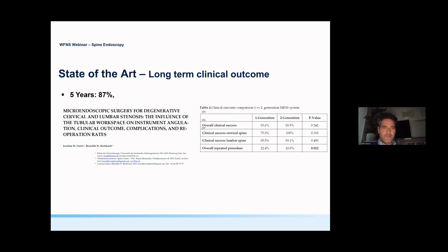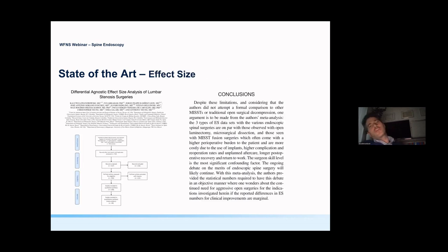Then if you go back to the literature and do a meta-analysis of a couple of thousand patients that have been operated either with a microsurgical decompression for lumbar stenosis or disc herniation, and try to compare, is there any difference to endoscopic procedures, unilateral, uniportal with continuous irrigation?